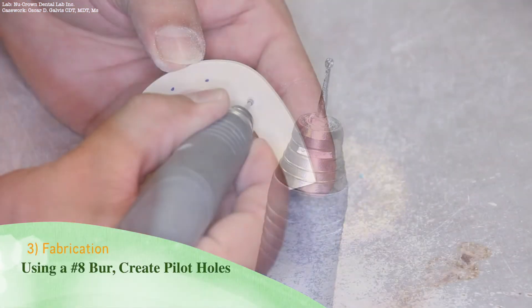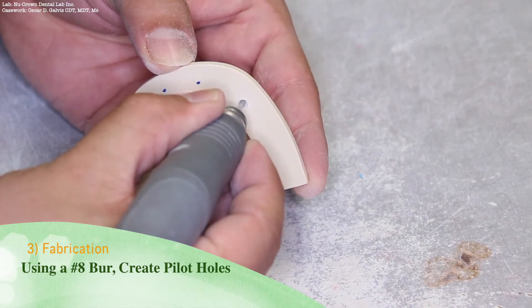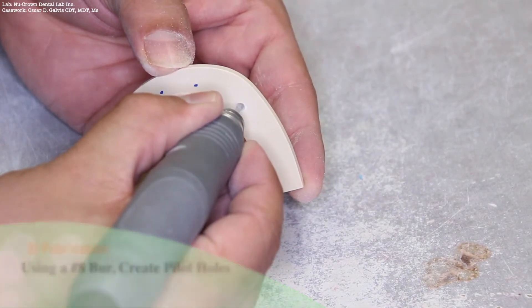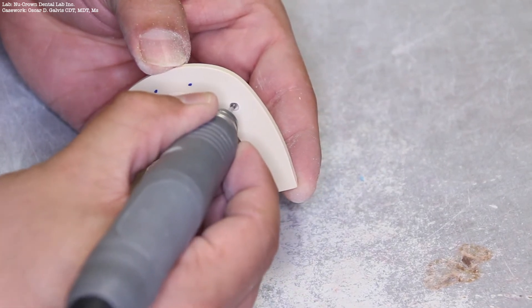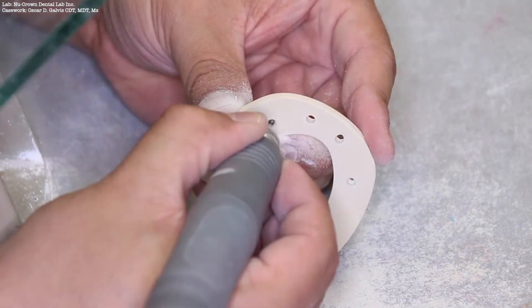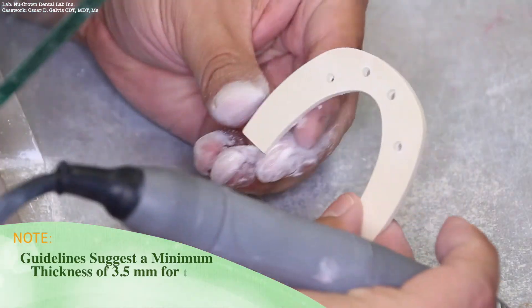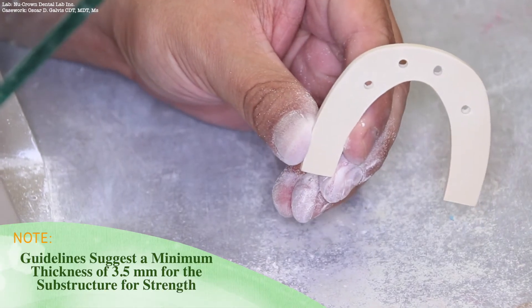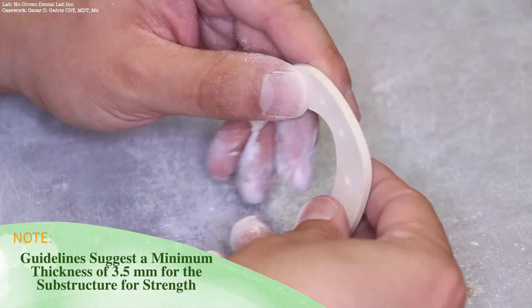Using a number 8 round burr, create pilot holes where the holes have been marked using the base plate wax. It should be noted that guidelines suggest a minimum thickness of 3.5 millimeters for any Trilor substructure.